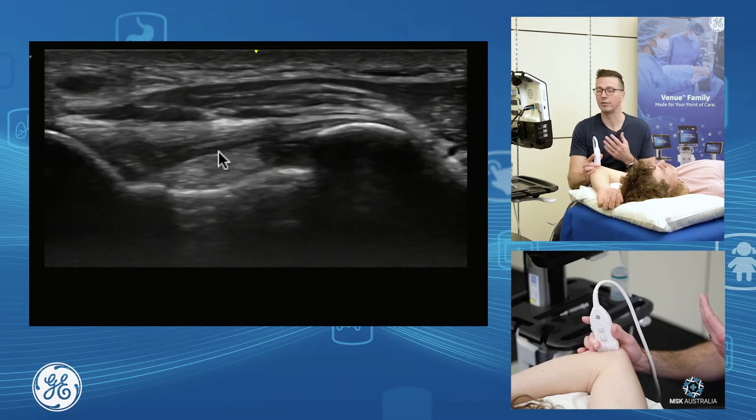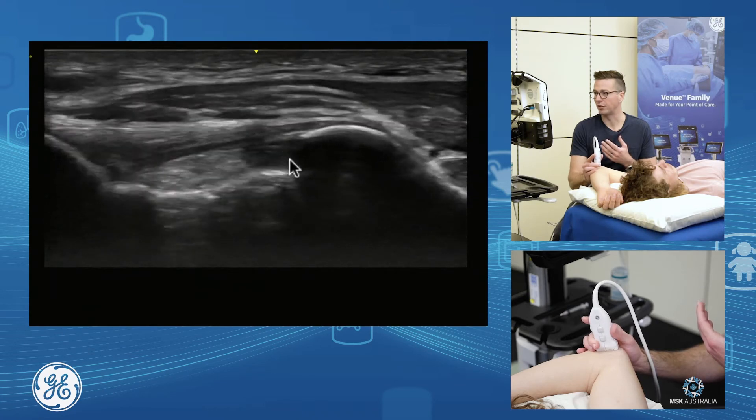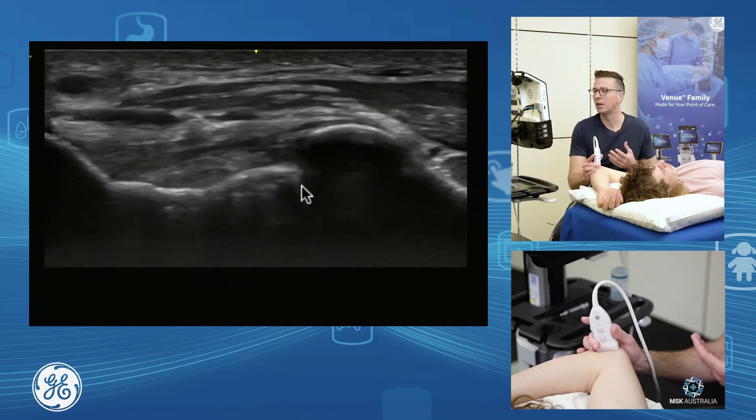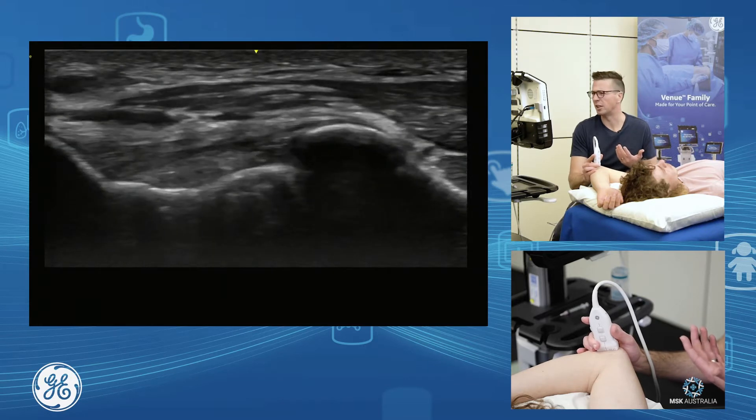We see the fat underneath in the joint and the joint space. So if you had an effusion or haemarthrosis, this is where you'd see it medially. Loose bodies of the elbow often sit in here quite commonly as well.